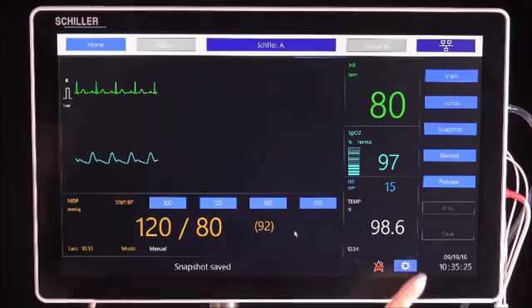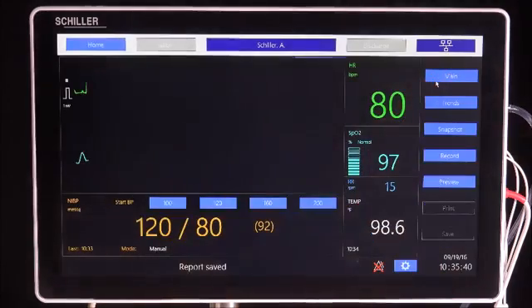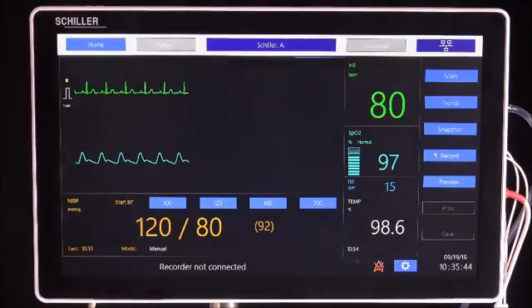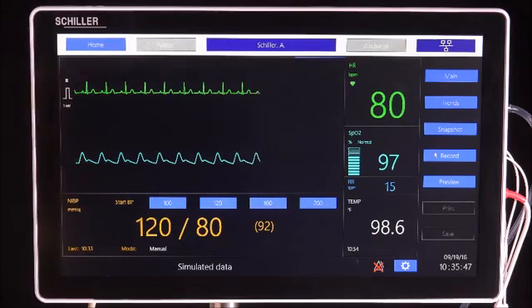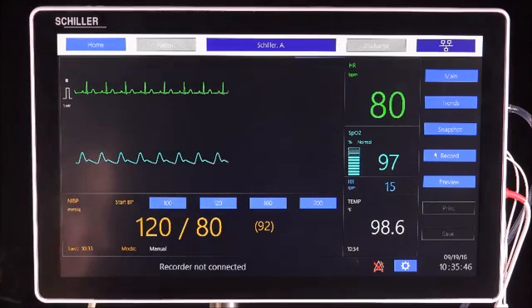The preview function will generate a report that can be saved or sent to the printer. The Save button will save a record to the local database. The Record function is for the thermal printer only. By tapping the Record button, a printout of the current real-time data can be obtained to generate a chart recording. The data to be printed is defined in the setup.